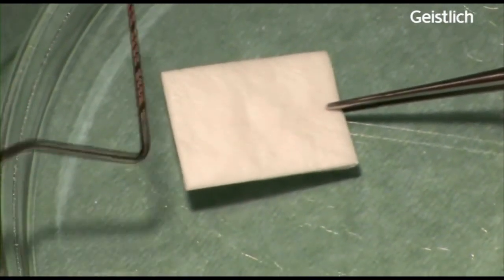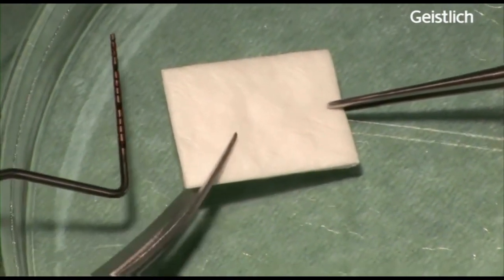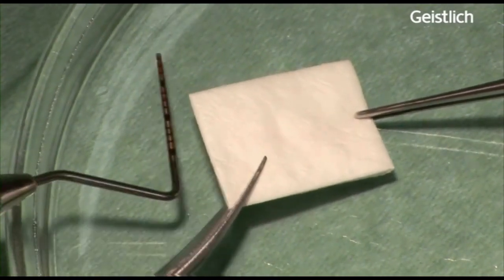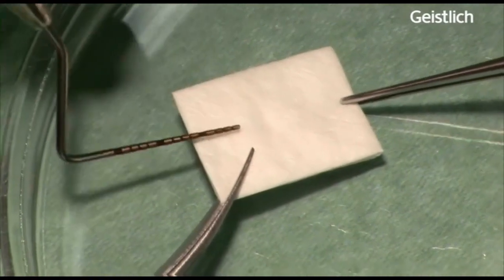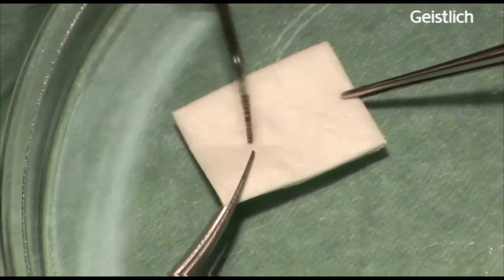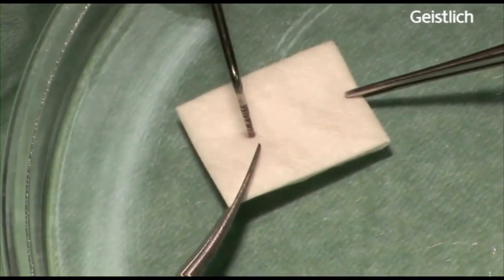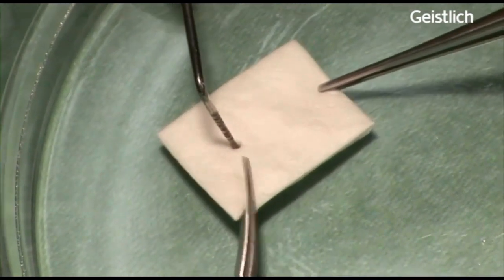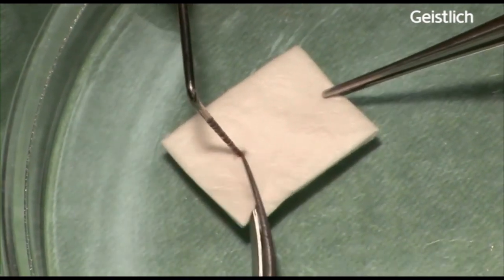Using this surgical technique, we are expecting to obtain a clinically sufficient width of newly formed keratinized gingiva. It is also expected to achieve an aesthetic outcome, less patient morbidity, and less costs compared to the treatment with a free connective tissue graft.